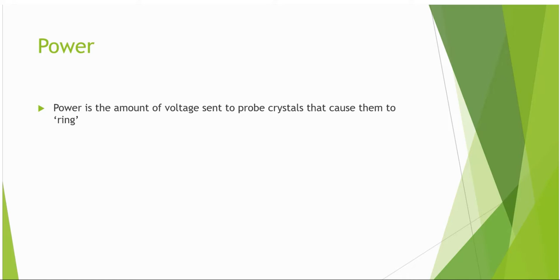Be aware that on some systems, the maximum value for power is 0 decibels, and then lowering the settings down into minus decibel values.